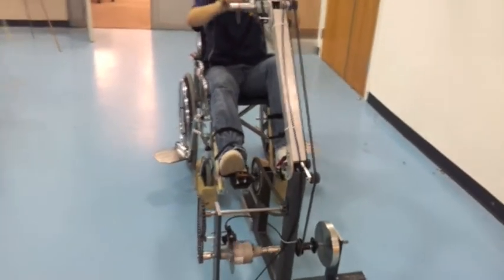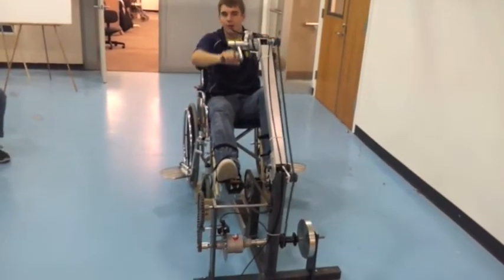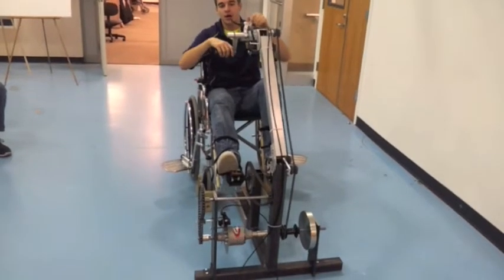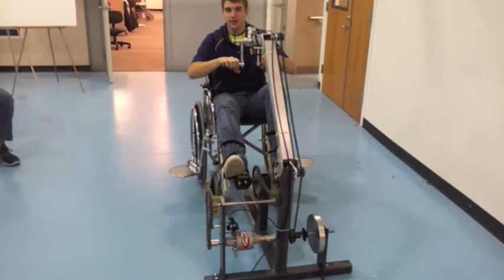And if I wanted to engage my legs and get another workout later, I have the option to do this whenever I want throughout the workout, and it is as easy as adjusting and locking in the handbrake like so.